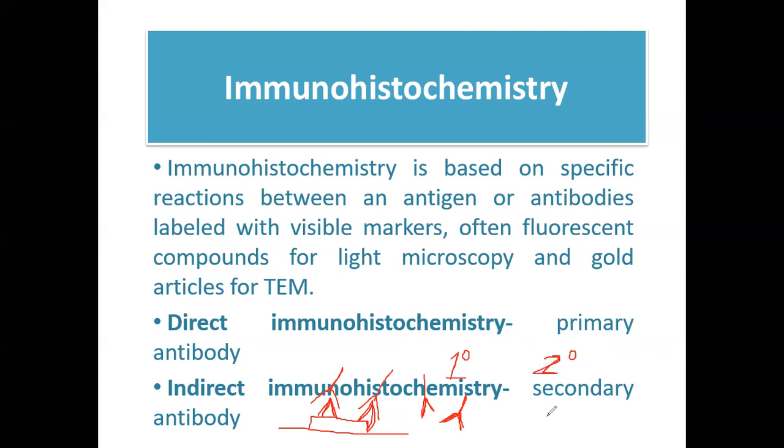Ano naman yung secondary reagent antibody natin? Yung secondary reagent antibody natin, sila yung label. Example, fluorochrome. Ang label natin, halimbawa lang ha. Ma'am, itong mga antibodies na ba to ay anti-A antigen antibody din sila? Hindi. These antibodies naman are directed against your primary antibodies.